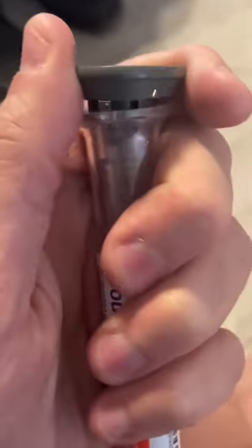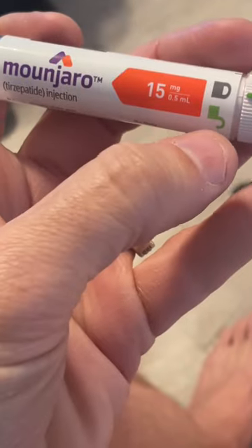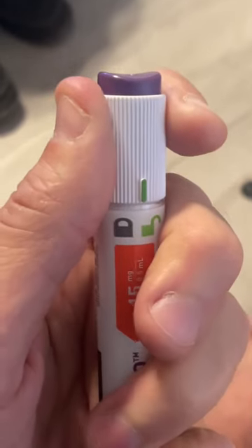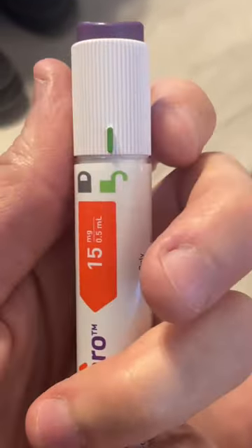Right now I'm going to take off the gray cap. If you have this, you can just remove the cap and you'll see the needle inside the plastic at the top. You're going to see this lock mechanism — gray is going to be locked. You're going to turn it over sideways to the right to the unlocked position, just like that.